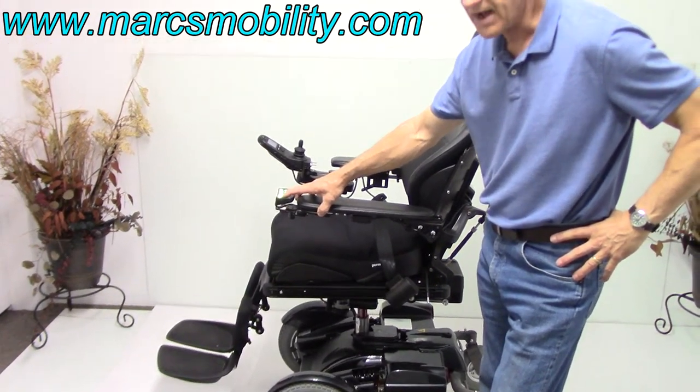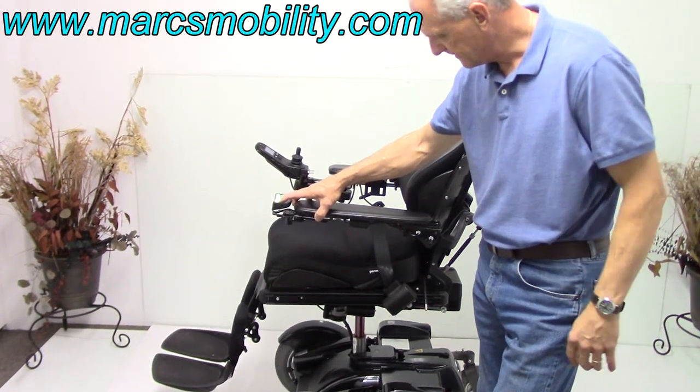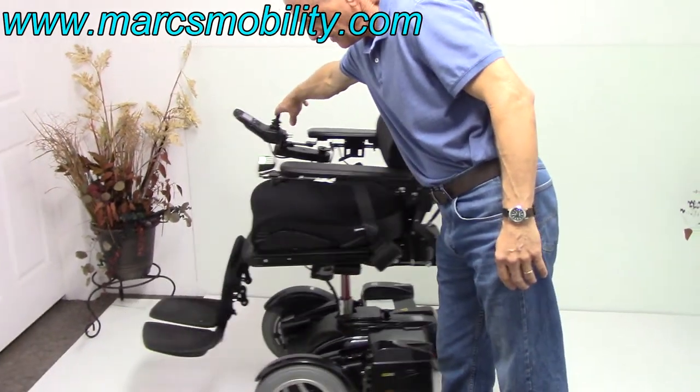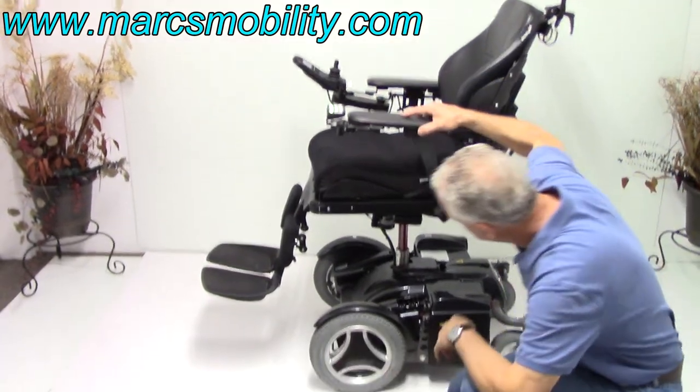Now this chair will still drive when the seat is elevated, but it'll drive at a slower speed. So now this is your 8-inch seat lift. Let's talk about the base.